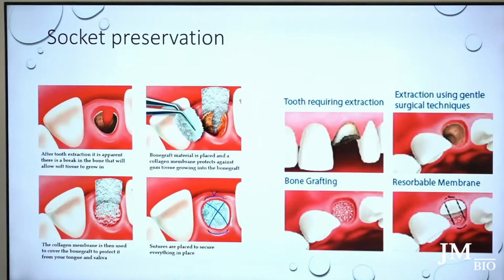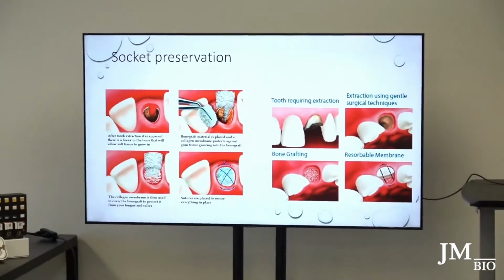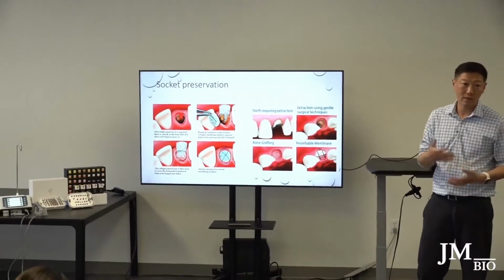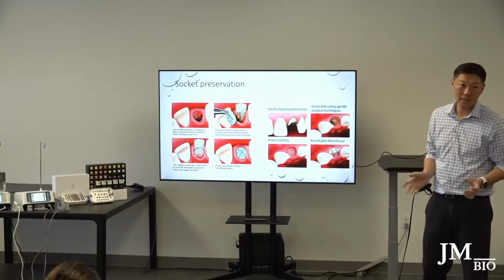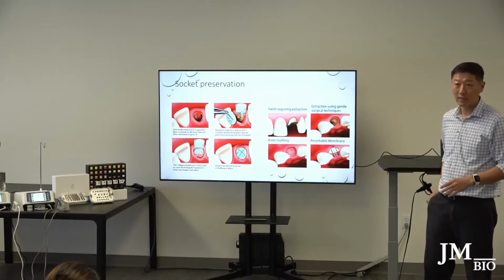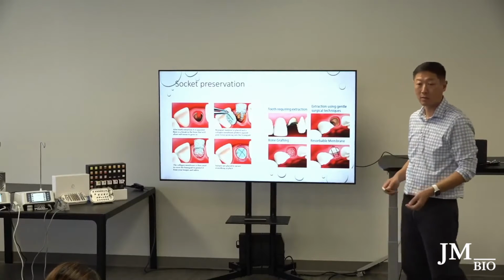If I cut the whole buccal plate off, anybody can take out teeth. But knowing how to take out teeth while preserving everything is a different story. Being good at it, efficient and fast is where you have to work on your clinical skills. I can't explain all that in one visit, but knowing how to cleanly take out teeth and close the patient up properly are very key factors leading to success down the road.